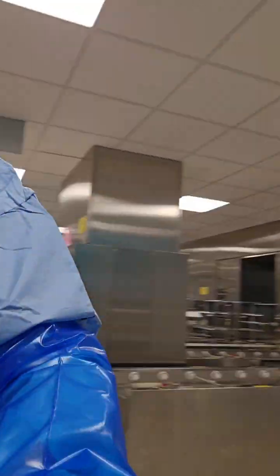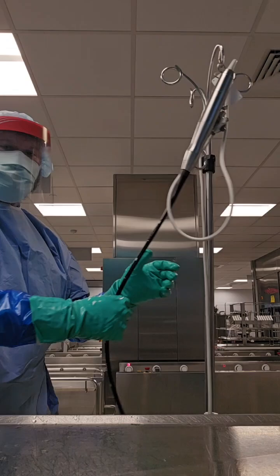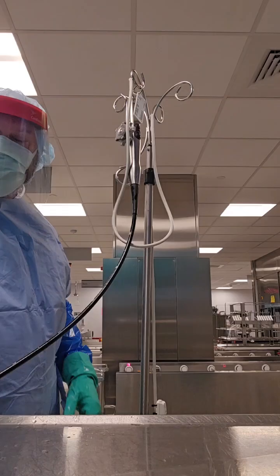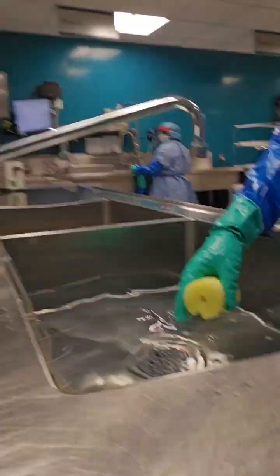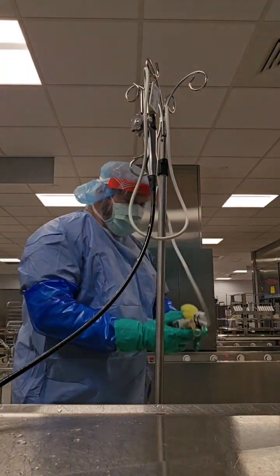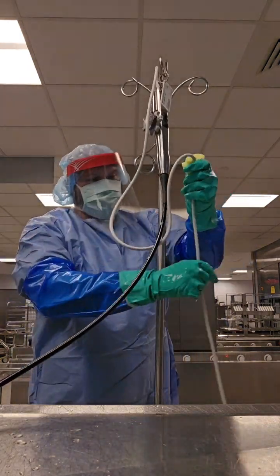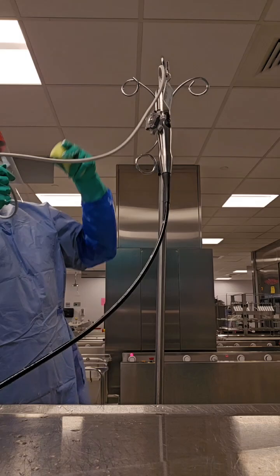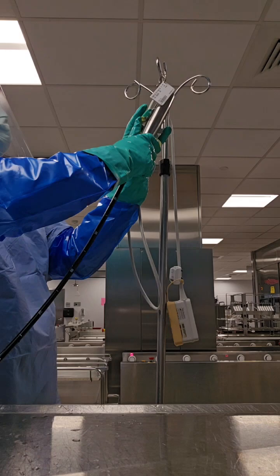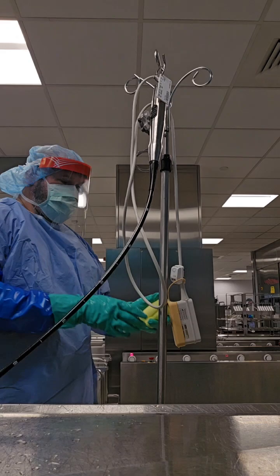Now let's go over the second method. This method involves using just a neutral detergent — no disinfectant wipe first. You can see I have the insertion tube in the sink. I'm going to saturate my sponge with some enzymatic and wipe down the whole TE probe with enzymatic detergent, from the connector block all the way throughout the entire surface of the device, including the insertion tube, handle, insertion collar, and insertion tube.